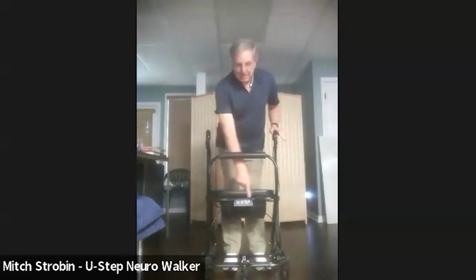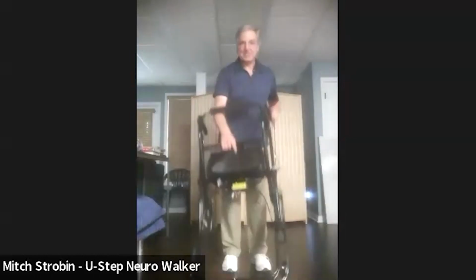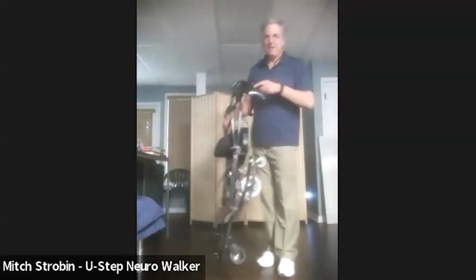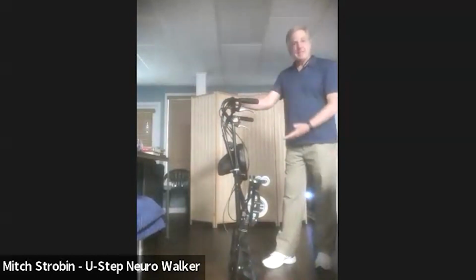Takes 30 seconds, maybe. So there's a latch that's called U-step. I can pull the latch up. There's a bar with a sticker. The sticker says, "Lift here to fold." So I will lift it straight up. And then there's a gray clip on the left side. That's it. We're done. It's nice and narrow. Can fit in the backseat of a car trunk.